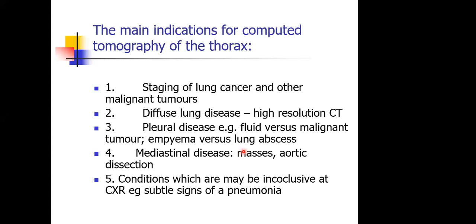The fifth situation is in conditions in which our interpretation is inconclusive following chest radiography. So we may use CT to give us more headway in such situations.